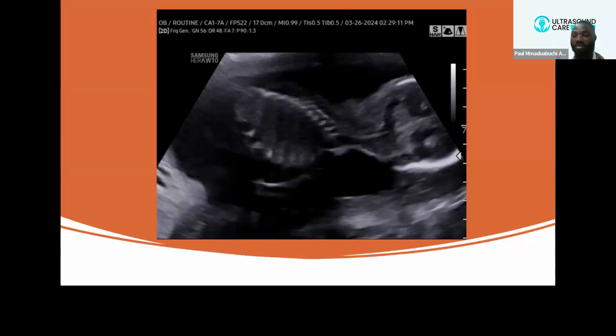I don't know if we should go on with the questions. He also asked how to differentiate normal physiological midline brain cysts from holoprosencephaly at the 11 to 13 weeks scan. Yes, it is an interesting question, because there is no physiological midline brain cyst in the first trimester. Maybe we can talk about the cavum velum interpositum. It is a normal physiological cystic structure in the middle of the brain. But holoprosencephaly is different.